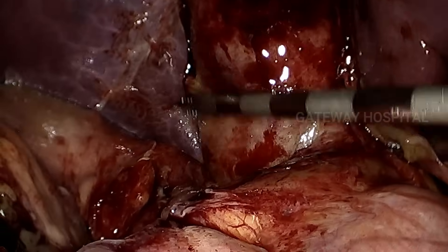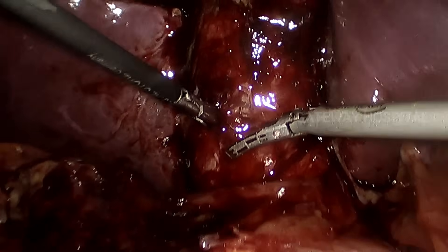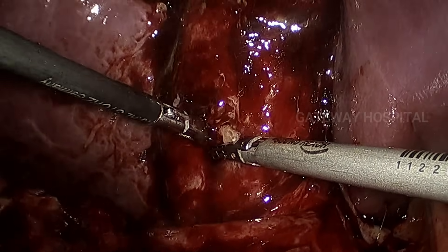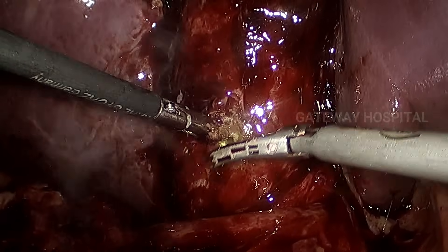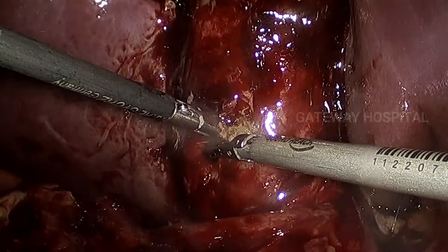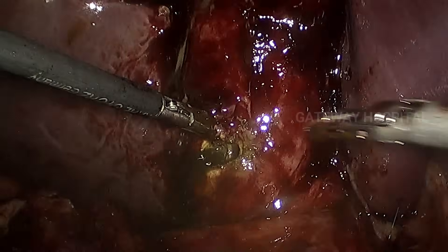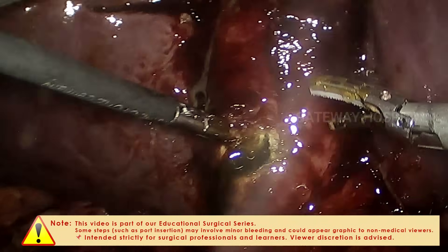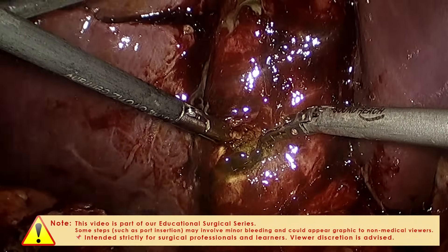In this case the Calot's triangle is frozen. So rather than going and trying to dissect at the Calot's triangle, we try to divide the gallbladder away from the cystic duct-infundibulum junction circumferentially. This is like a modified retrograde technique.